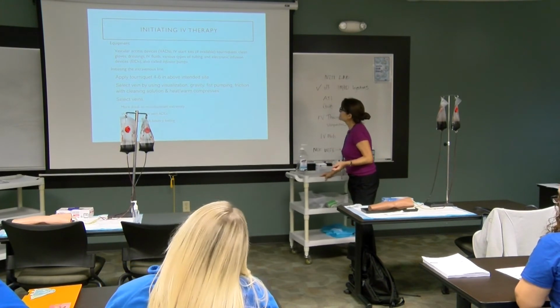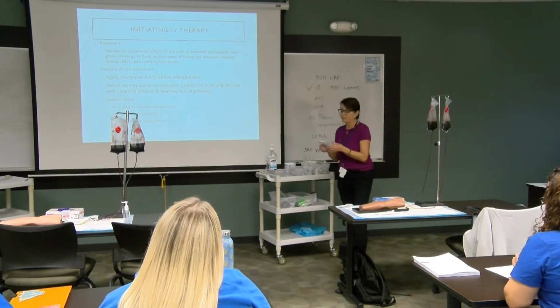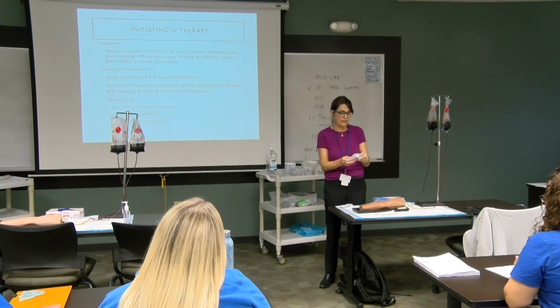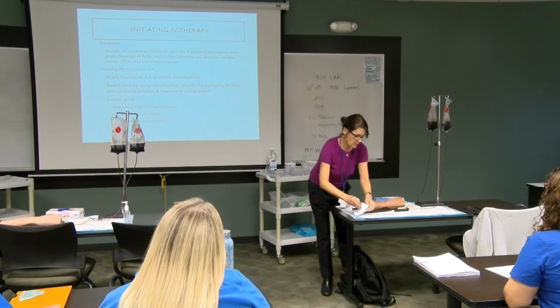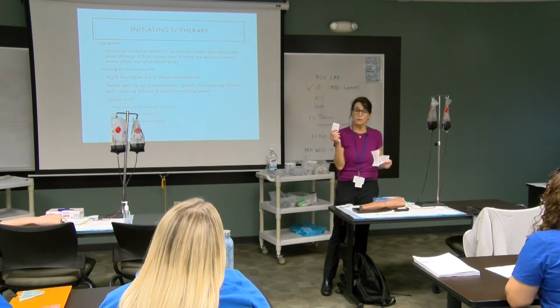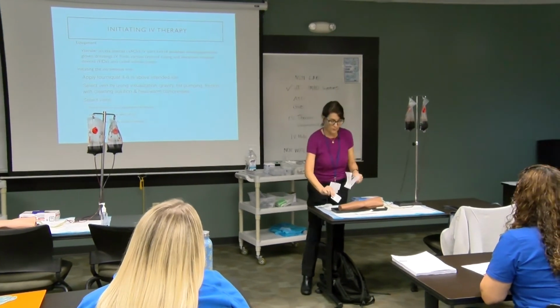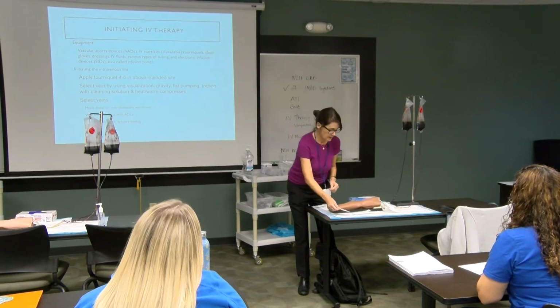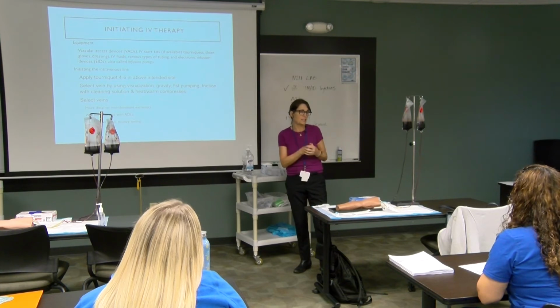You need some supplies to start, and some places have IV start kits. I have an example of that here. In the start kit, we have the tourniquet, the tape, and then ChloraPrep, which is the recommended cleansing agent. Some places still use alcohol, but CDC recommends ChloraPrep. We also have a Tegaderm dressing. In places I work, they don't always have these start kits, so then you just need to gather the supplies that you need.